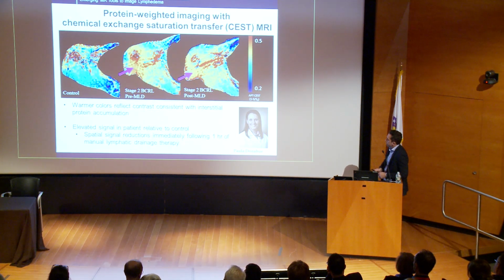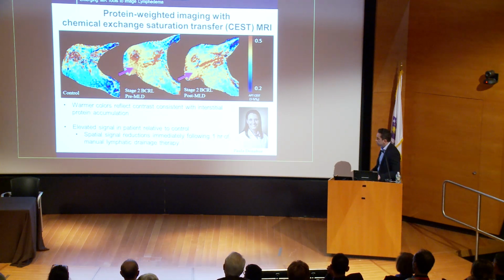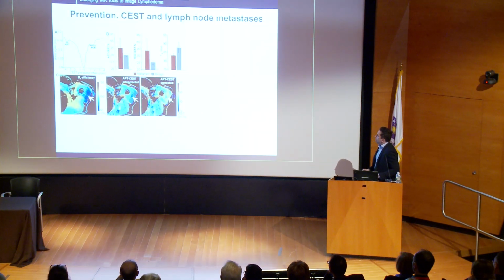So we're now doing a crossover trial looking at sort of sham interventions along with MLD, and sort of this negative pressure therapy as well to see whether we can look at effects of this. And if you can show that, then you can show that these therapies work. And it's also relevant if you want to look at pharmacological therapies or even surgical therapies, that sort of thing.